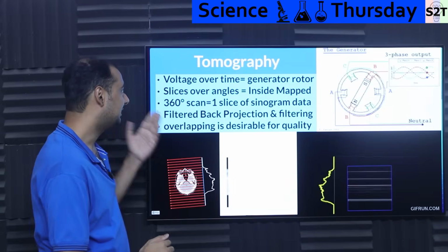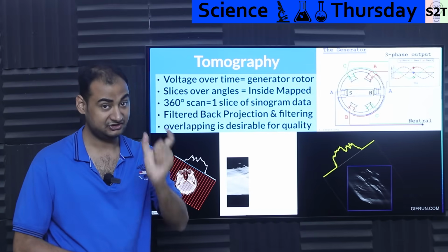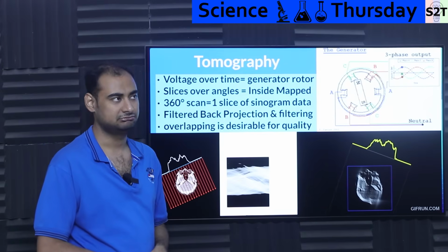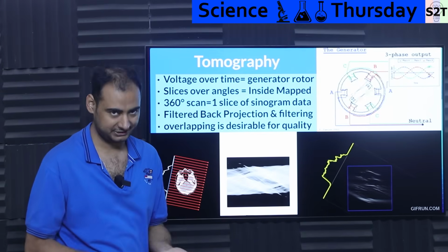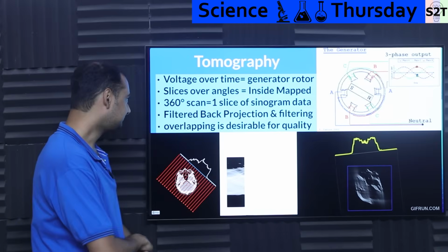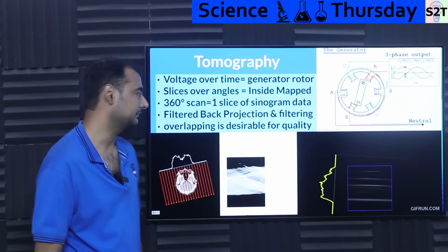So we come to the part of tomography. Let that be very clear. The reason CT scan always has that C is that theoretically, on paper, this technology has been known since the 1930s. We knew how to do this. It's just that we could not do it physically. Without computers, this is like, lol. So the C part is always there, and it is compute. Without computers, this would not be possible.